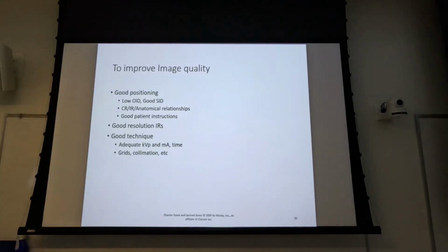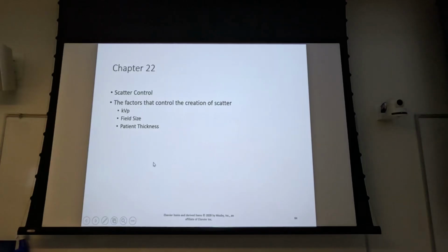I talked about going to 10 feet last week. I think you get to a point of diminishing returns at best at 10 feet. You don't get any benefit out of it, or I didn't anyway. So high resolution image receptors, good technique, all that.